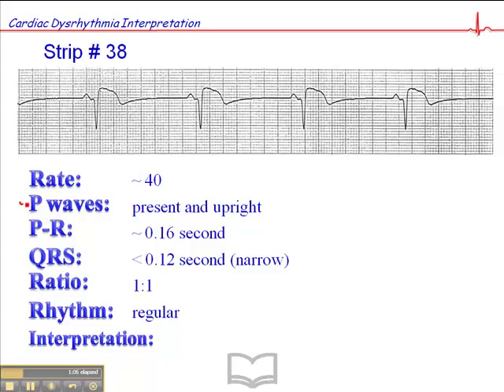We have P-waves, we have narrow QRS, we have a 1 to 1 ratio. The only thing abnormal here is this heart rate of 40. So basically what we have is a sinus bradycardia with a heart rate of 40.